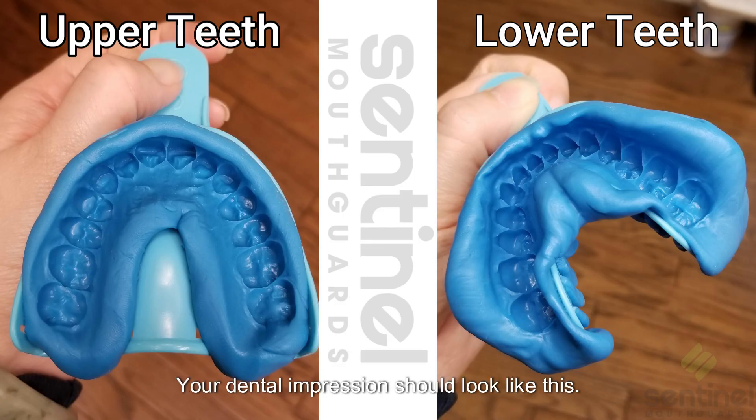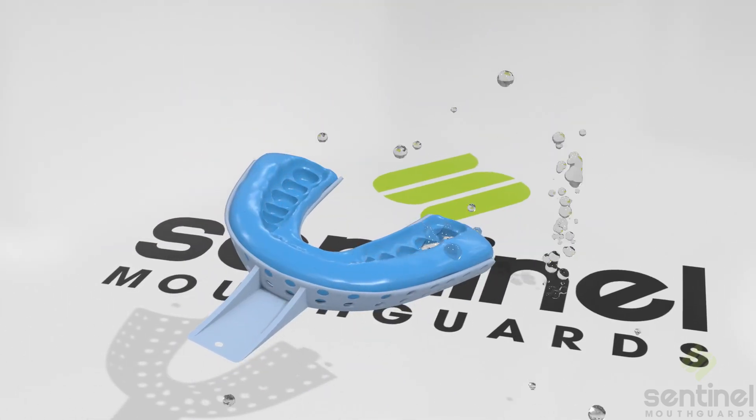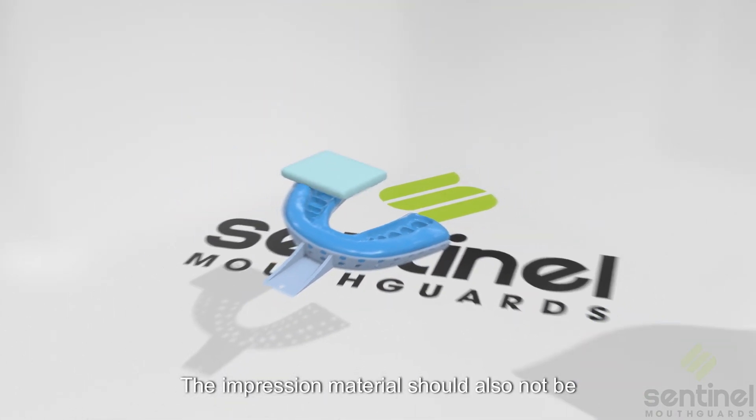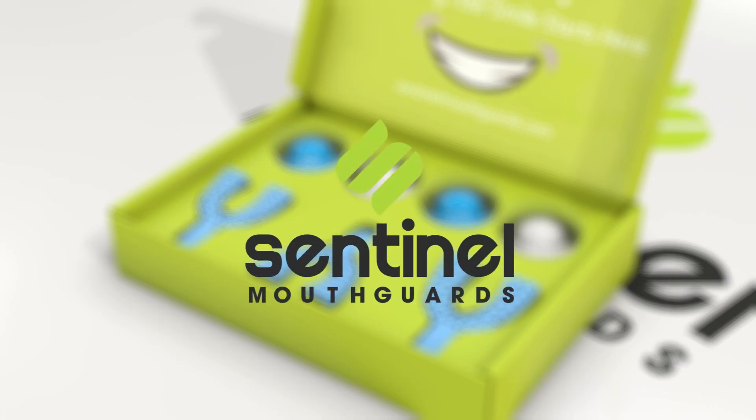Your dental impression should look like this. Rinse with water and pat dry. The impression material should not be separated from the tray. Keep the putty intact with the tray and mail back to us.